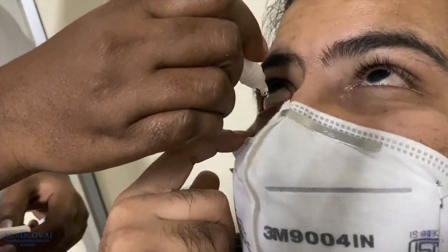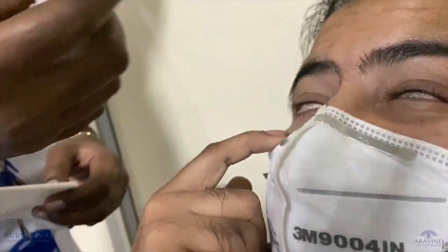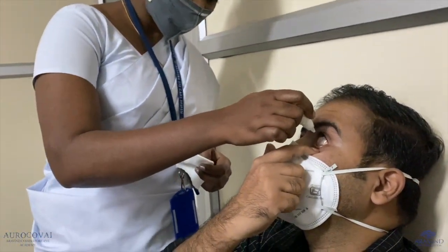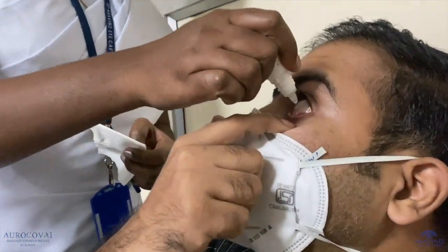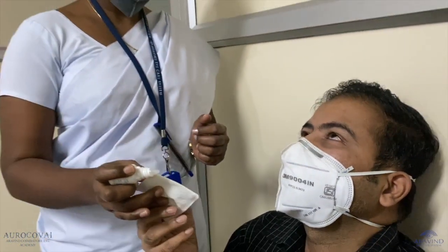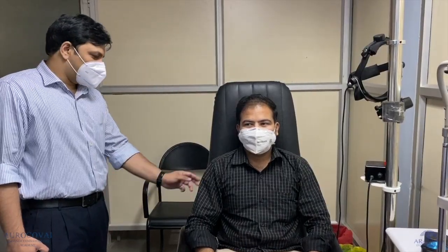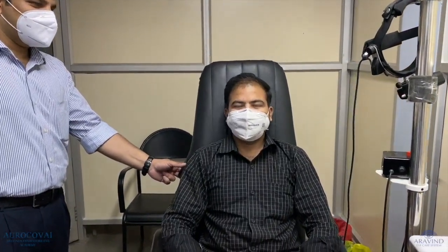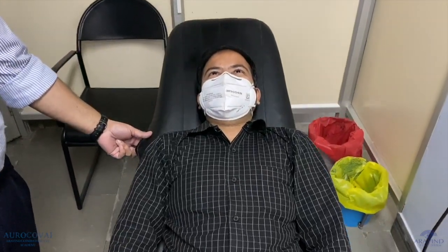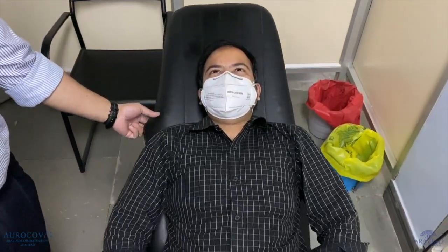Coming to patient preparation, the primary thing is to ensure that the patient's pupil is well dilated so as to have a thorough view of the retina. Bilateral cycloplegia along with topical anesthesia helps in enhancing patient cooperation. Before starting the procedure, we have to explain it thoroughly to the patient, and they should be made to recline comfortably.